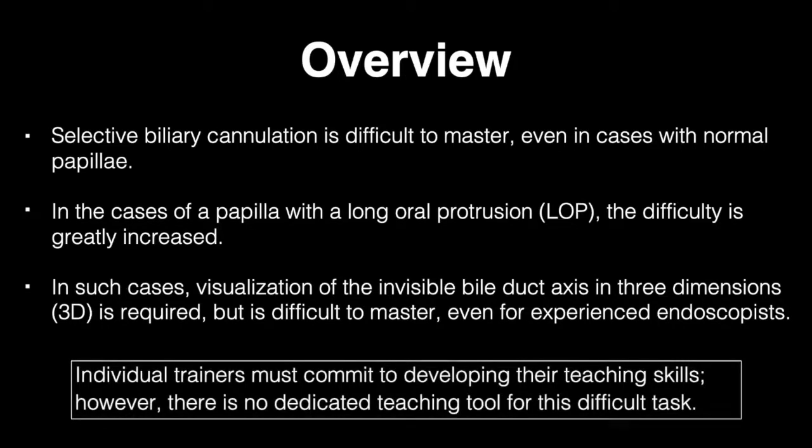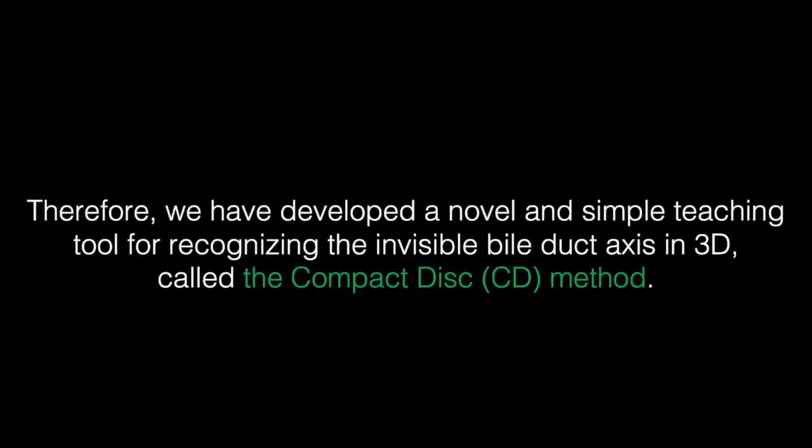Individual trainers must commit to developing their teaching skills. However, there is no dedicated teaching tool for this difficult task. Therefore, we have developed a novel and simple teaching tool for recognizing the invisible bile duct axis in 3D called the compact disc method.